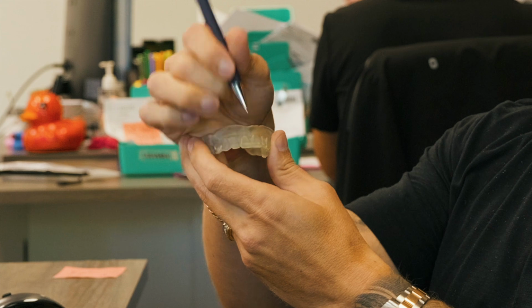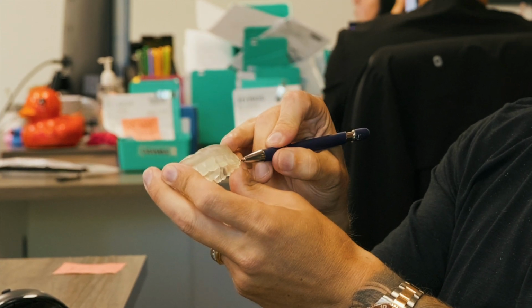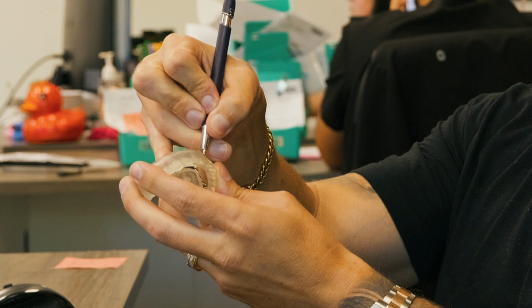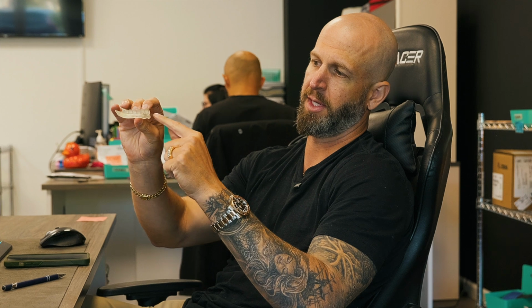If you were going to use the denture, you can take a measurement from the incisal edge, and let's say the standard is 15 millimeters. You're going to measure 15 millimeters from here, which is typically about 4 to 4.5 millimeters above the cervical, and then mark there. And so we can also make a digital cut in here as a reference point for a digital bone reduction guide. And the same thing for the lower, for the MUAs. It's just that when you're reducing lower, these don't serve well as a reduction guide. So again, going back through and taking cross-cut measurements and going off existing teeth.